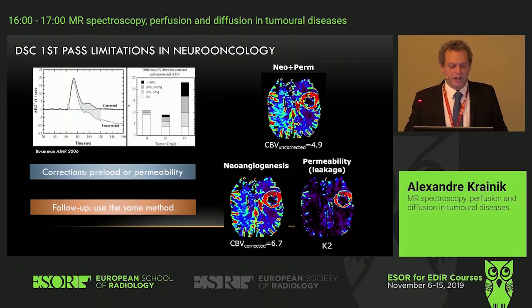Anyway, it's a conversion of the signal change. You see that the curve will get under the baseline when it's uncorrected. Then in a certain way, when you try to estimate the area under this curve, it should be quite different if there was no leakage.